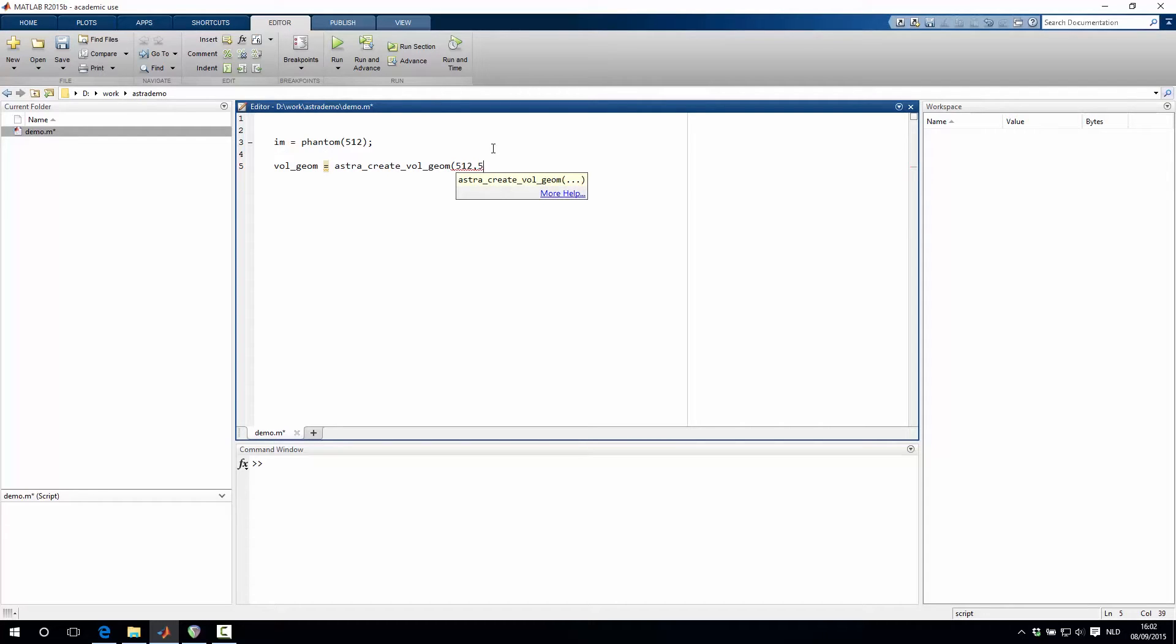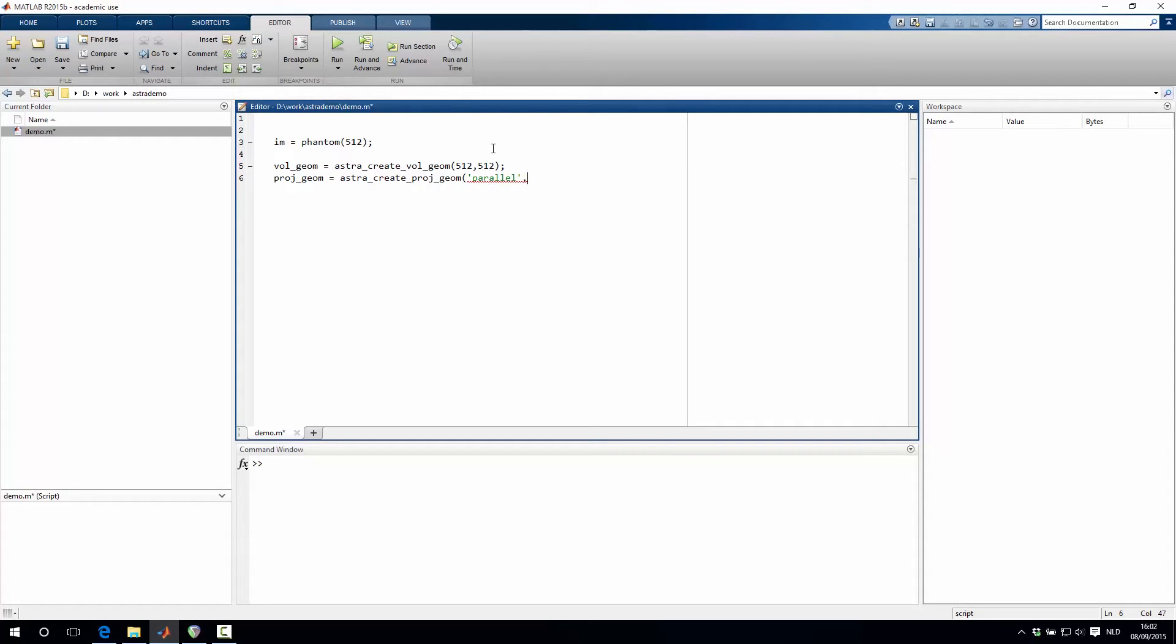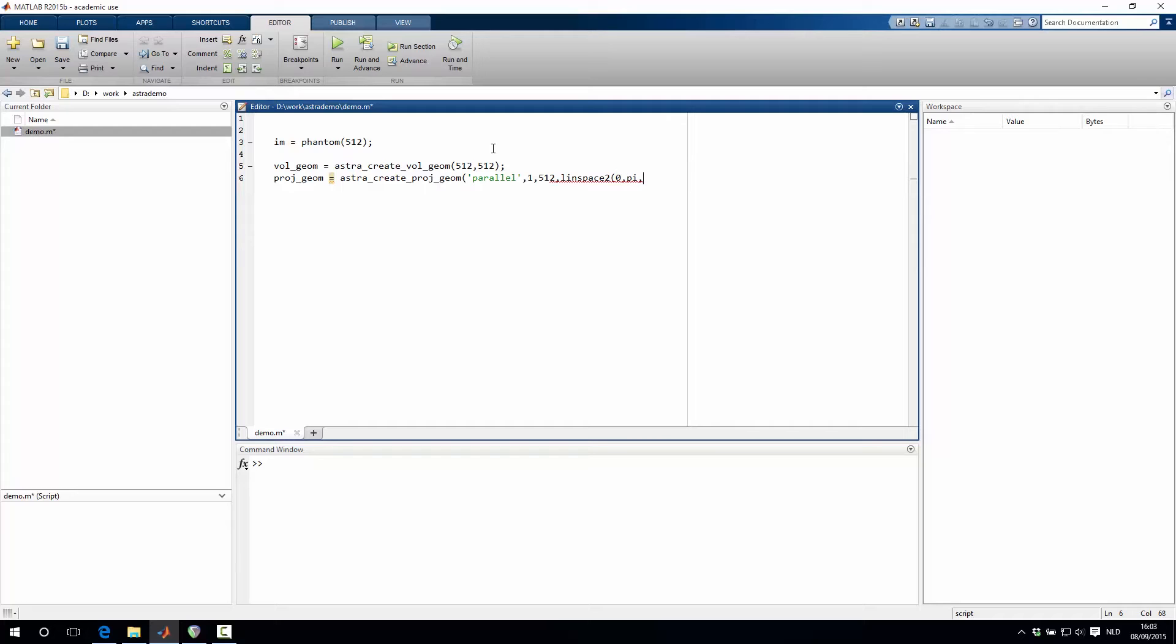Then we create the projection geometry with the function astra_create_projgeom, and we want to use a parallel beam projection geometry, where the detector width is 1, where there are 512 detector pixels per projection, and we want to space the projection angles between 0 and pi, and let's say we want to have 180 projections in total.